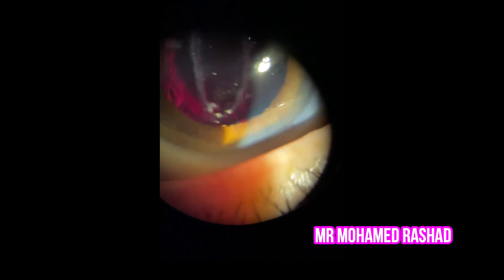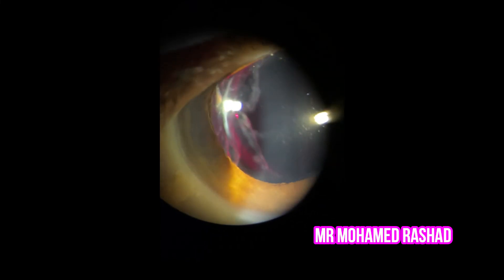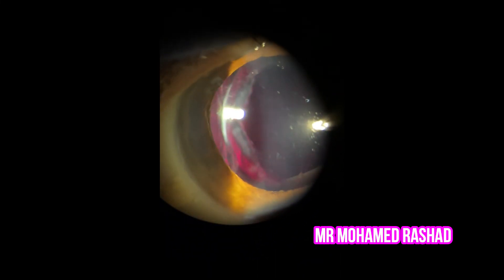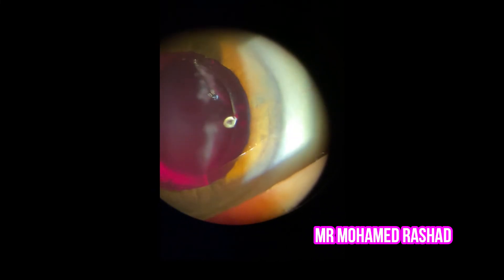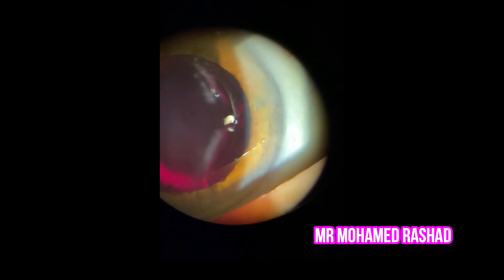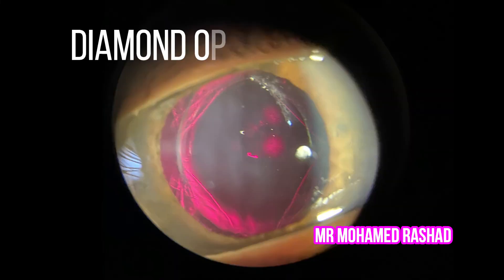We finish the vertical line of the crochet and then go to the sides, from the center to the periphery, and then on the other side, from the center to the periphery as well. Make sure the focus is adjusted throughout. Now we have the diamond-shaped opening completed.